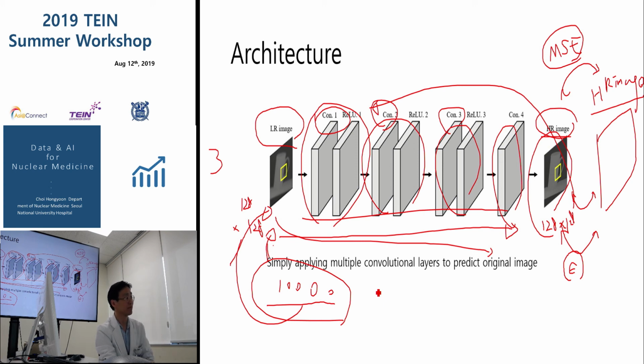At which stage do we apply this model, after reconstruction imaging or before reconstruction? Both of them are possible. Firstly, many papers attempted this on the fully reconstructed PET data. However, recently, many papers tried this deep learning model at the sinogram level to recover the low dose PET data to high dose PET data.